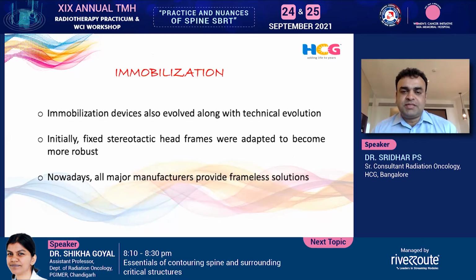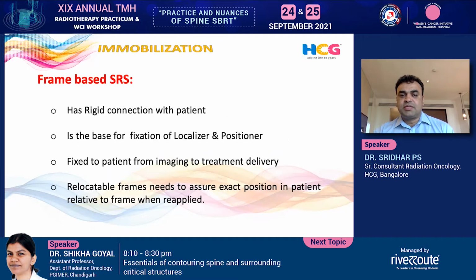These immobilization devices also evolved along with the technical evolution. Initially we used fixed stereotactic head frames, which were adapted to become more robust. We always thought that fixing, particularly at some times, is always good. I remember when I was at AIIMS, even with the fixator in an SRT program, when we looked over 25 days, there was a lot of difference as far as reproducibility is concerned. So nowadays, all major manufacturers provide frameless solutions. Putting the frame is always an issue.